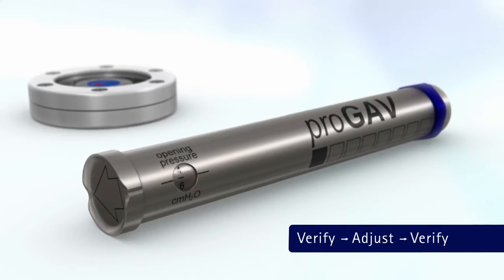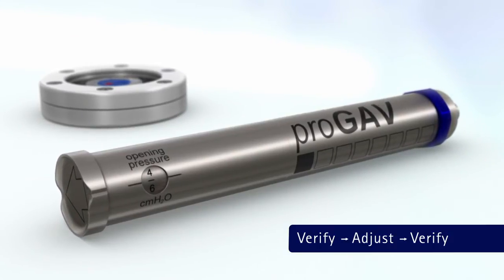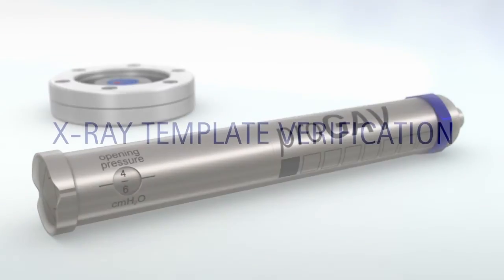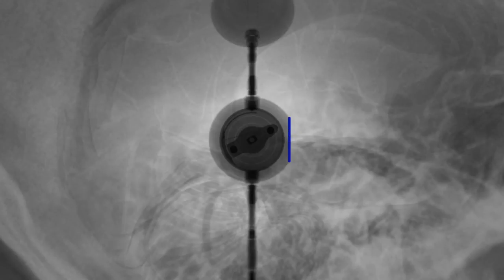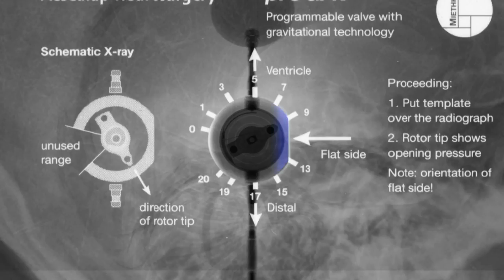Verification of the adjustment can be made using the verification steps described earlier in this video. If the setting reflected on the verification instrument or compass differs from the intended setting, then an additional adjustment is necessary. To verify the current setting of the valve using the X-ray template, place the template over the radiograph. Adjustments of the ProGav shunt can be verified using the ProGav verification tool, but must be confirmed by radiograph.